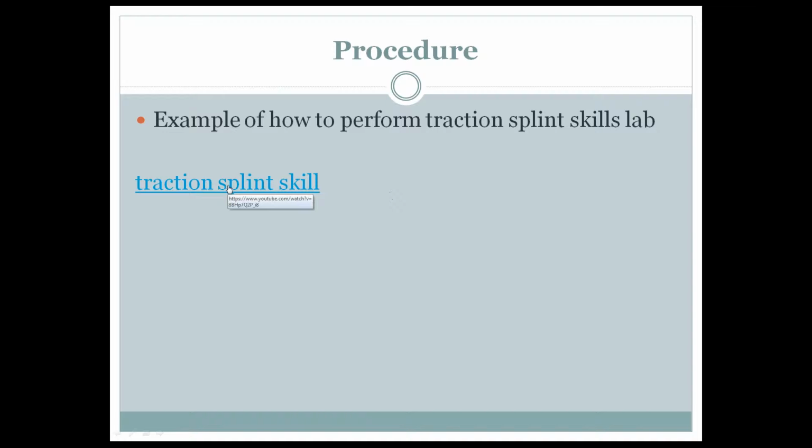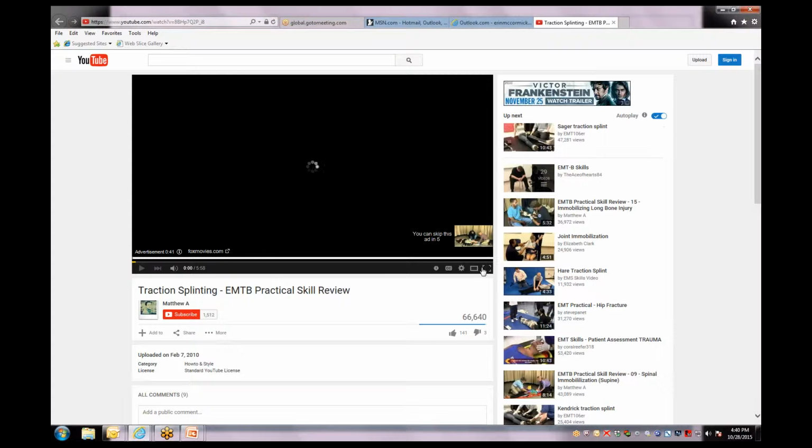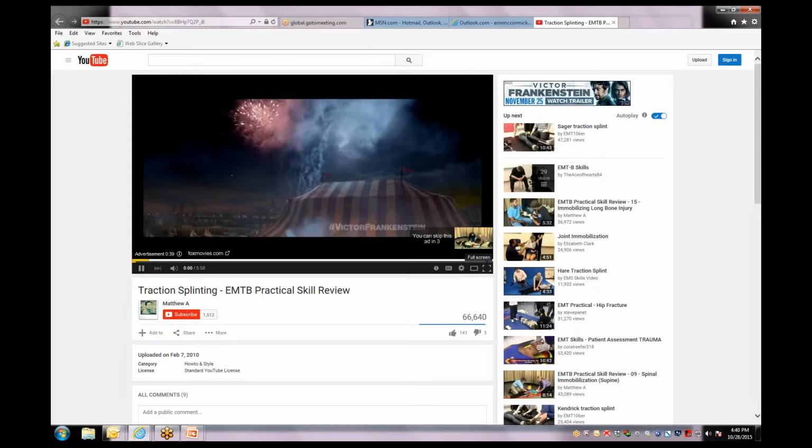And now I'm going to show you how you're going to perform this skill. This video is going to give you an example of how you're going to be tested on this skill and what you want to do to perform the procedure accurately.